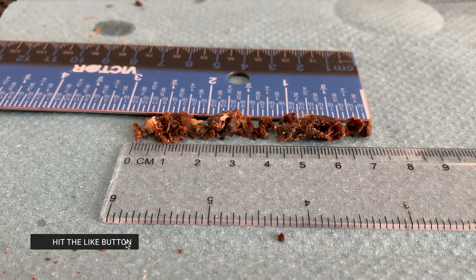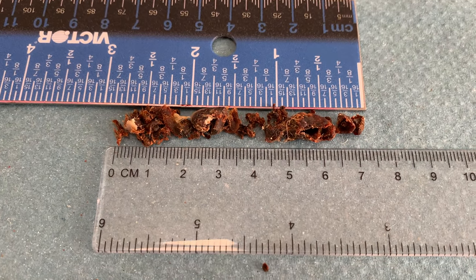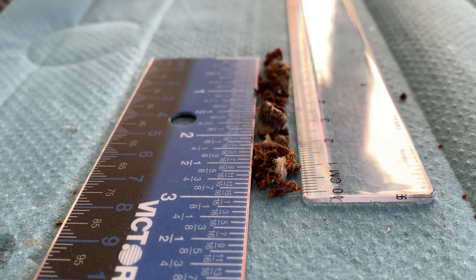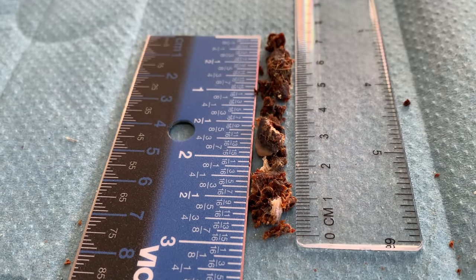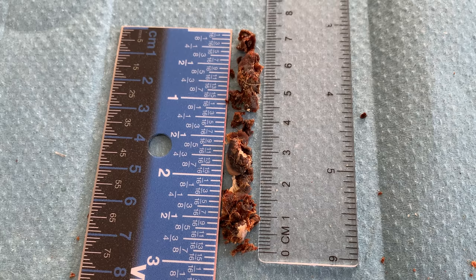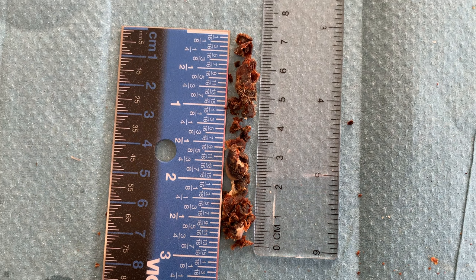Seven centimeters — I'm going to say that's three inches of anybody's money. So three inches of ear wax came out between both ear canals, and not thin pieces either — some pretty chunky pieces. Wow, what an amazing one! That was a really, really good one. I hope you enjoyed that as much as I did. Look after yourselves, look after your ears and look after one another — we'll see you again on Wednesday. Take care, bye everyone!